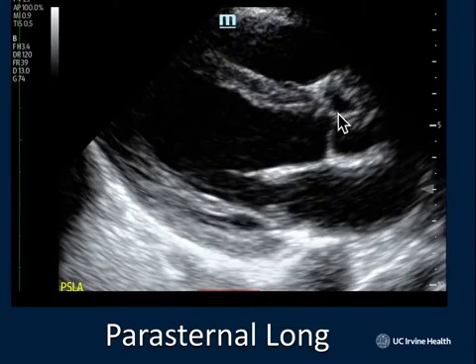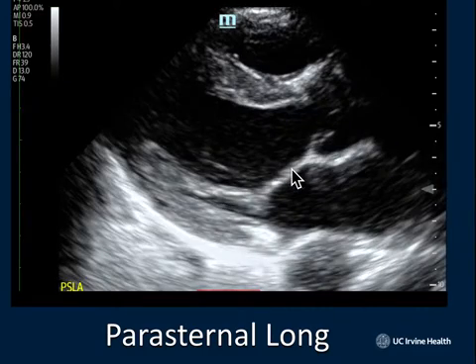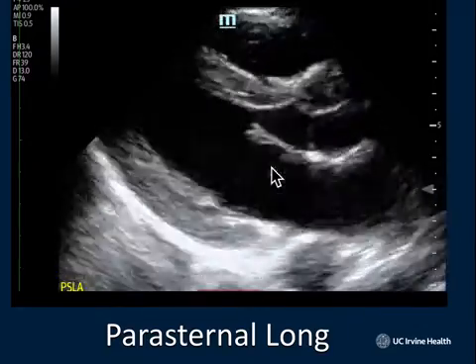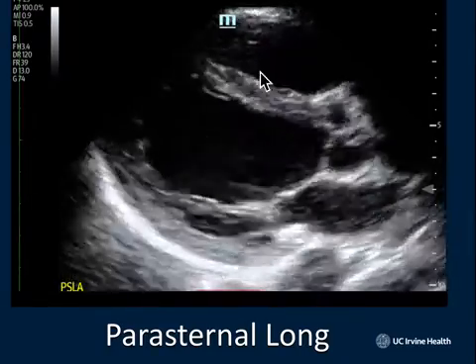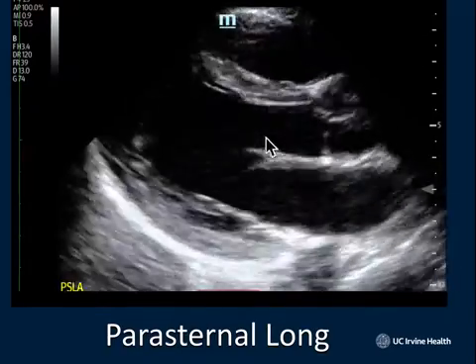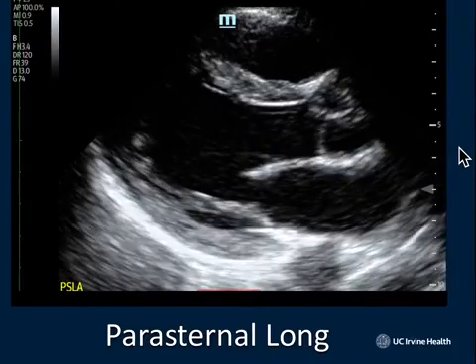And if I back it up here, you might be able to see, it's not cooperating, but oh, here we go. Maybe if I can get it to come back here, you can see how this mitral valve wants to come up and smack that septum, which it's doing actually quite well. And what you guys are going to learn this year is dropping an M mode spike right through here, and you'll see on M mode how close that mitral valve actually comes to smacking that septum. The closer it gets, the better the ejection fraction is of the heart.